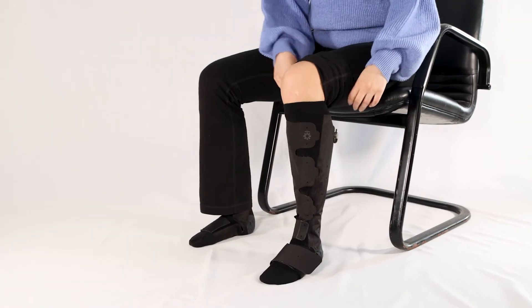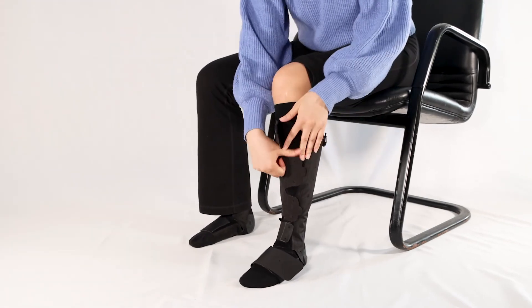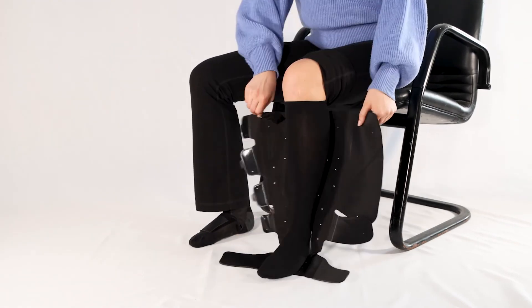Unhook the hook and loop straps, remove the sleeve and liner, and store flat until further use.